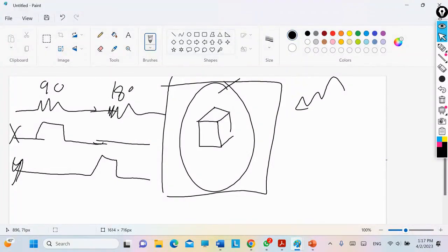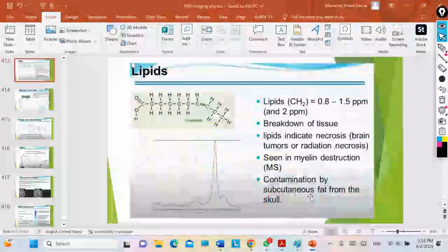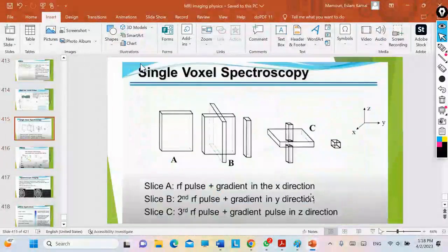It will look like this. Imagine you are working with axial, coronal, and sagittal views. You want to take the voxel in all three views. In the first, axial, you did it, and in the second, you will take it as if you are taking it in the y-axis. So, you will proceed like this. And this image here shows you better. This is the first segment.